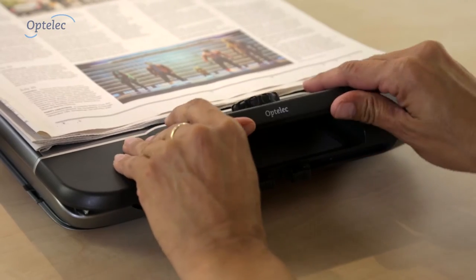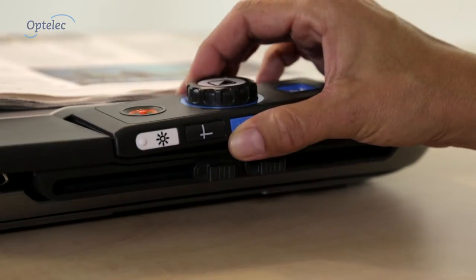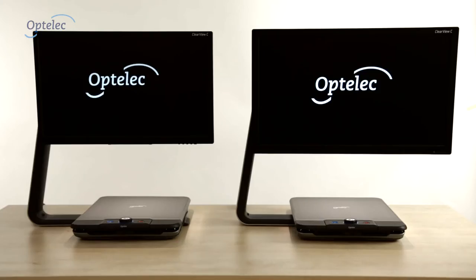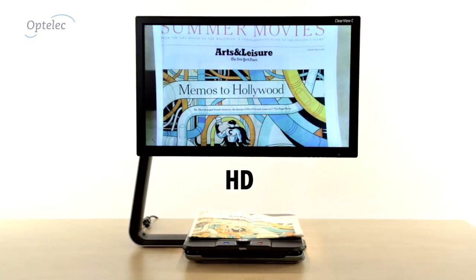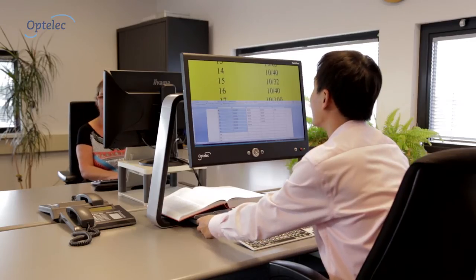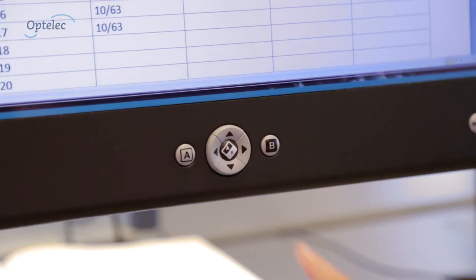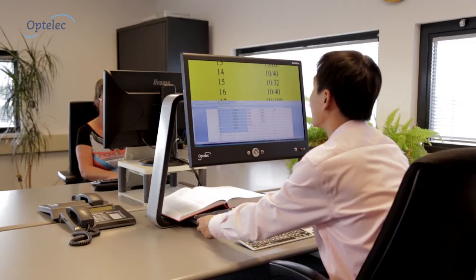The product's customizable setup enables you to choose the model that suits your needs. Choose a larger screen to see more, or a high-definition camera for lower magnification and a sharper, vivid image. And when you are at work, you can display the Clearview C image and the computer image on one monitor with the optional twin view monitor.